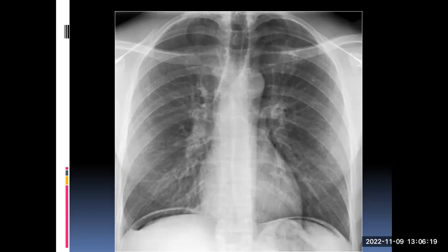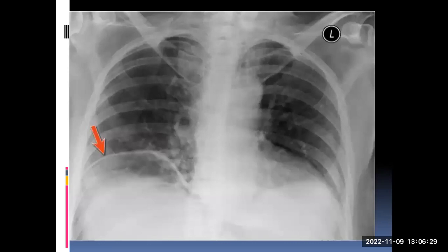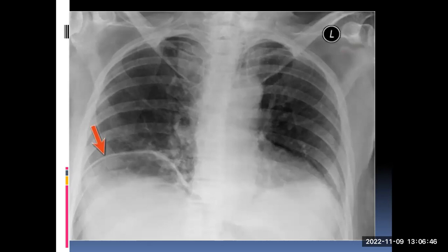Air can be in abnormal places outside the thoracic cavity. You can see air under the diaphragm — this could be a post-surgical patient or maybe some abdominal problem with rupture of a viscus. Sometimes this air under the diaphragm can be so extensive that you might even think it is just an atelectatic band; but that is actually the hemidiaphragm, with so much air beneath it.